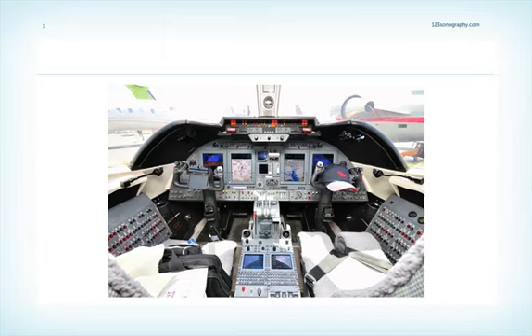But still, you need to know at least some basics. The keyboard of your Echo machine is like the cockpit of an airplane. And just like every airplane has a different cockpit, every machine has a different keyboard. But the general features of the keyboard are the same across the different ultrasound platforms. And even though some machines have 1,000 functions, some hidden behind touch screens and buttons and who knows what, in reality you will only be using a few.